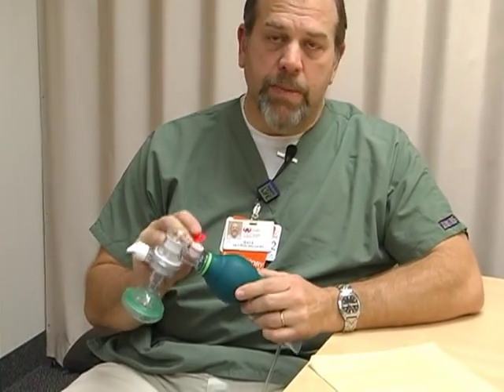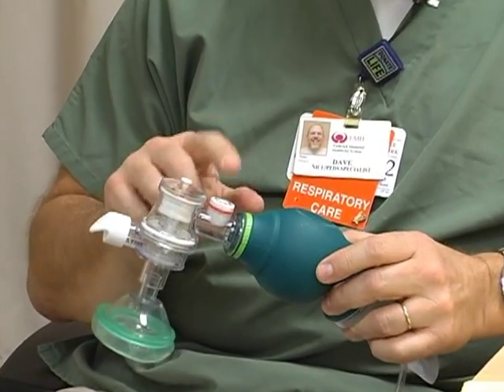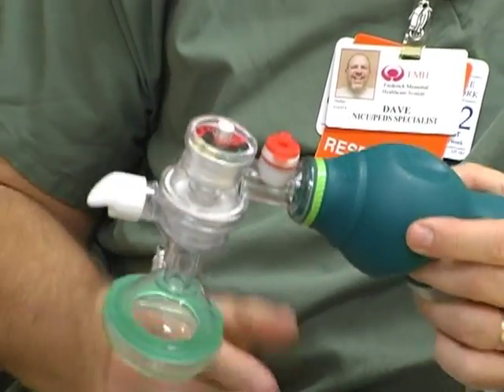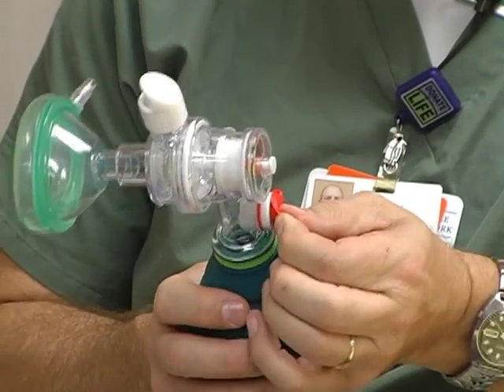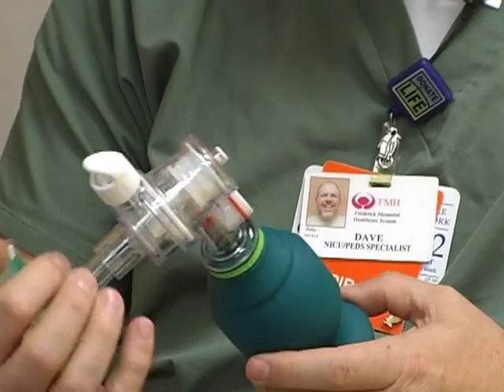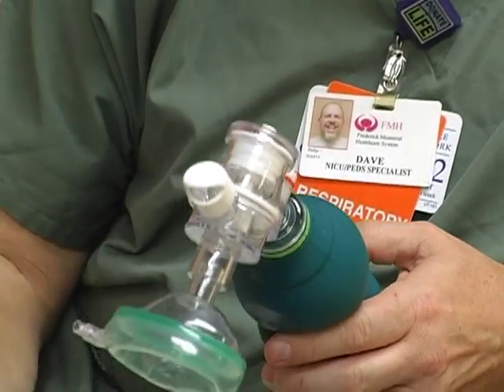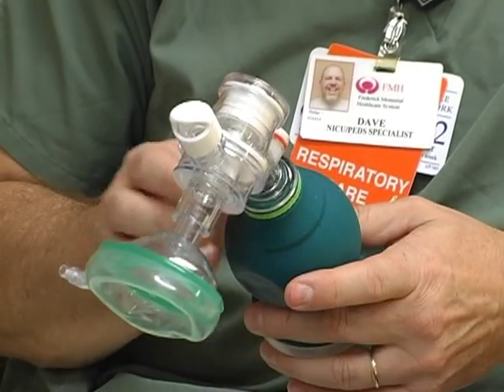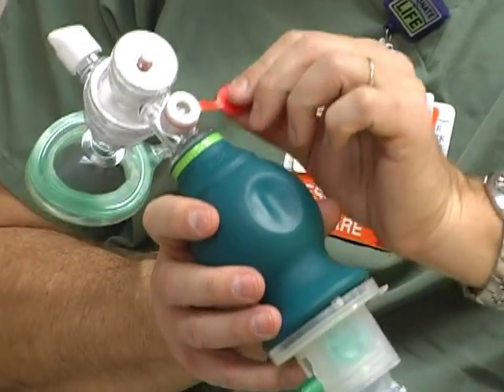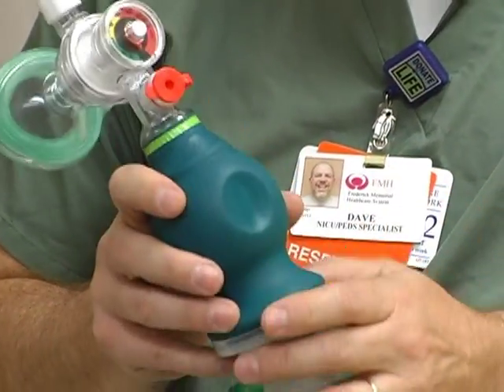The first and most important thing is this little orange cap right here. This is a pop-off valve, and this orange cap is a cover for the pop-off valve. When using this device, you need to make sure that the pop-off valve is open so it doesn't cause any trauma to the baby. With the pop-off valve open, it releases at 35 to 40 centimeters of water pressure and doesn't cause over-distention or over-pressure inside the baby's lungs.